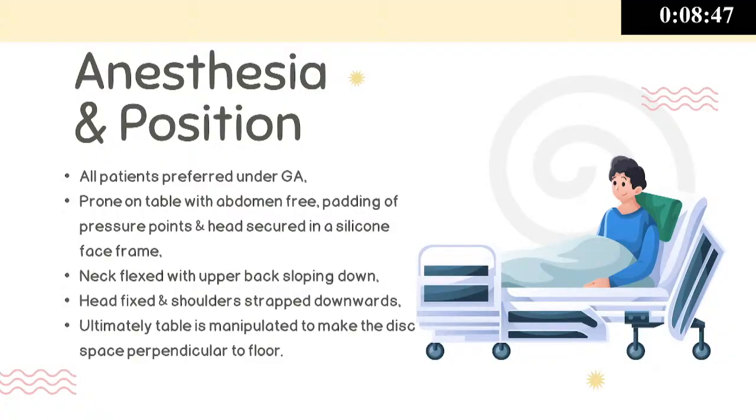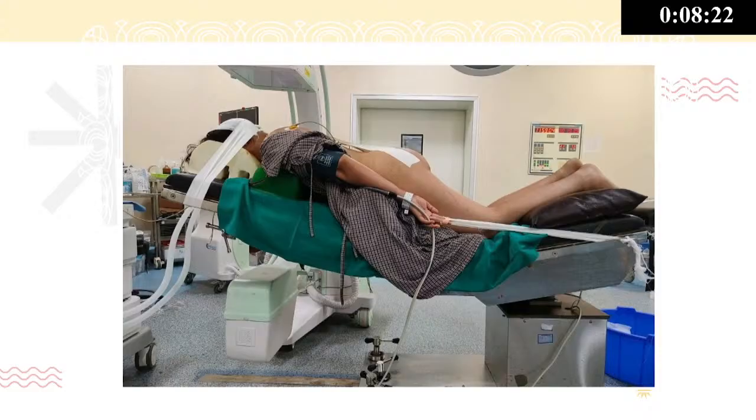Kyphosis, it is a deformity where we do not do a posterior surgery. Now, this is the standard equipment that you require that we've discussed earlier yesterday. All patients are taken under general anesthesia, positioned on the radiolucent bolsters, and the neck is kept flexed. I'll show you the image which will give you a better picture of how the cervical spine is positioned.